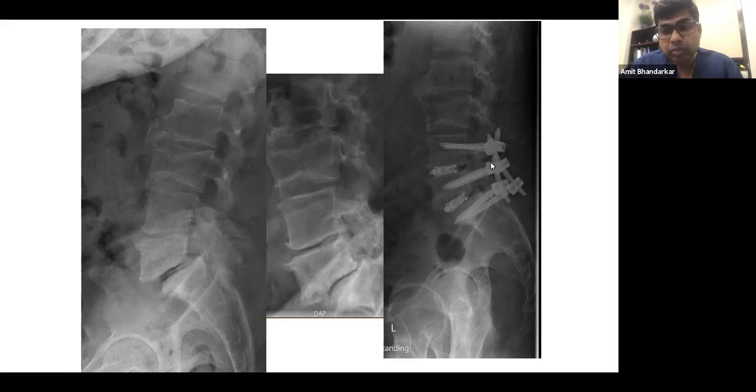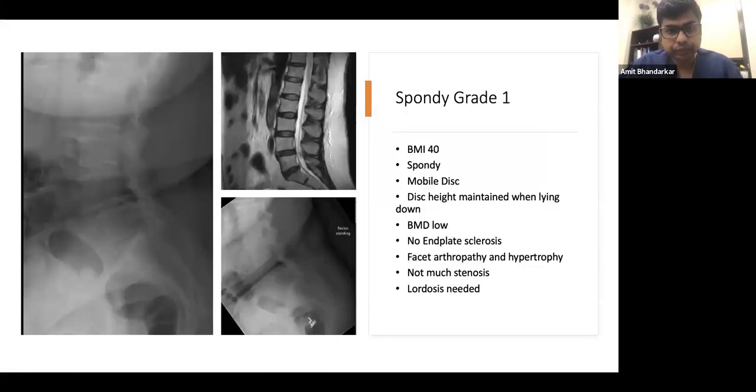Again, in this patient, because I was aware that I may torque the screwdriver early on and not be able to achieve the required lordosis, I used parallel expanding cages, which had a fixed lordosis to them, instead of a cage which expands in lordosis. Another example I can show you is a routine case that we usually get, spondylolisthesis.